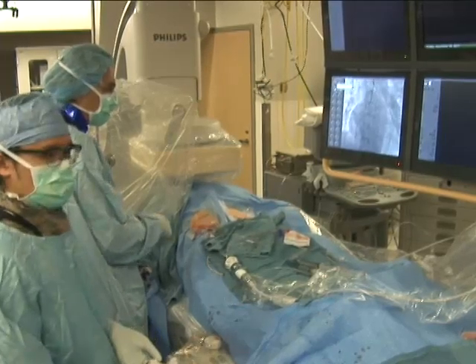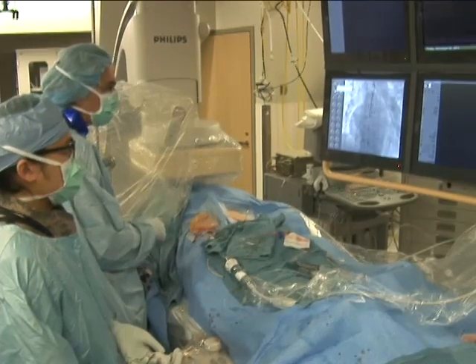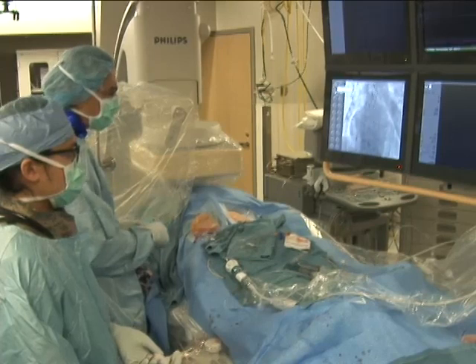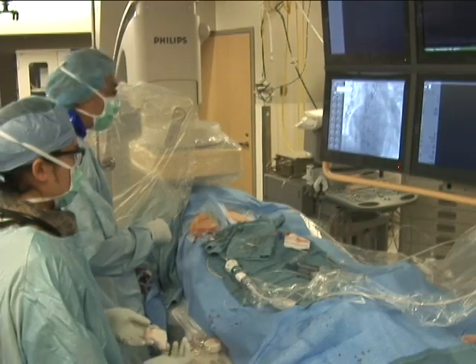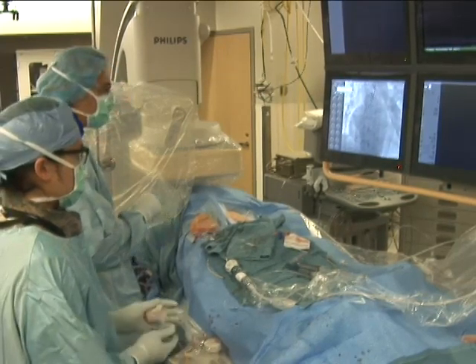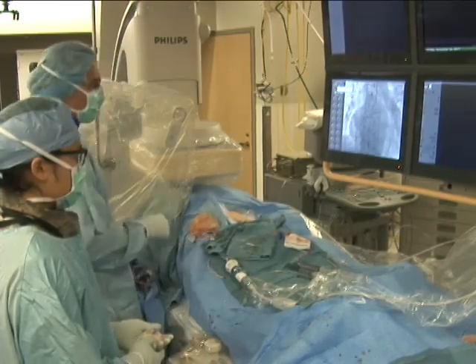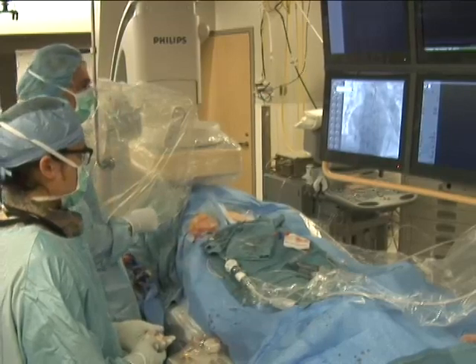If the procedure is being done with echocardiographic guidance, images should be obtained immediately if there is post-procedure hypotension, specifically to look for pericardial fluid. After completing the procedure, the patient is discharged from the cath lab with standard post-catheterization management and monitoring.